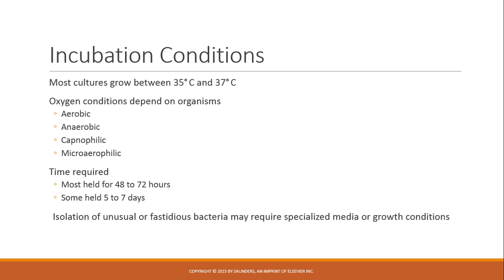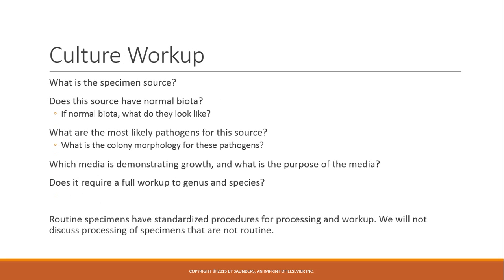Time required: most cultures are held 2 to 3 days. Some of them are held for longer if the organism takes longer to grow. So if you isolate an unusual, slow-growing, hard-to-grow organism, you may need to use some kind of specialized media or growth conditions for that. And we'll talk about those individual circumstances when we get into the organisms.